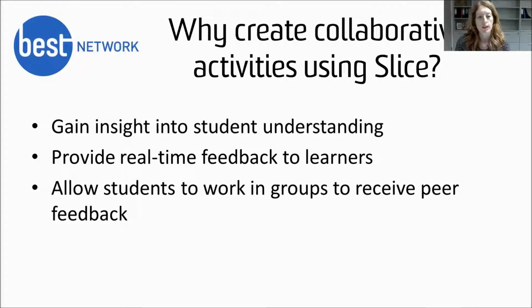We can use this therefore to provide real-time feedback to learners, and it allows students to work in groups to receive peer feedback. So the flexibility of the tool allows us to either give the students the ability to view each other's annotations as they're made, or to look as though they're annotating individually.